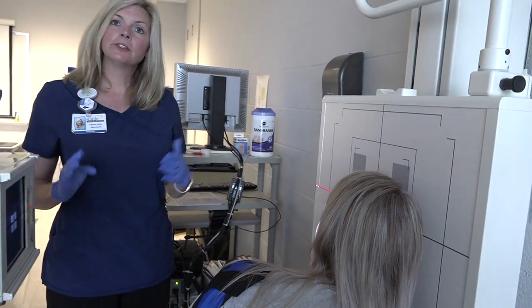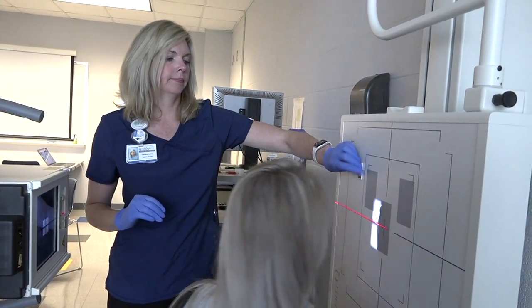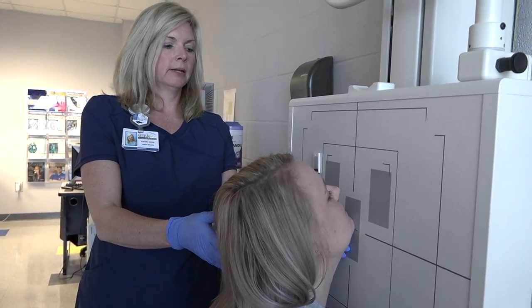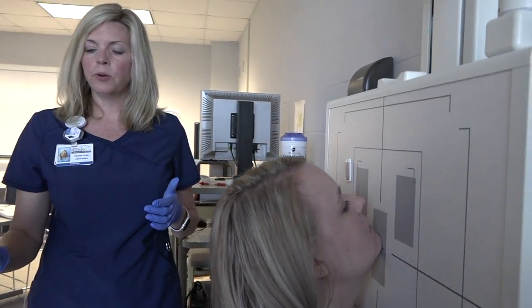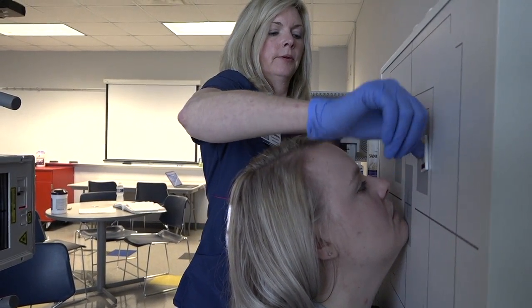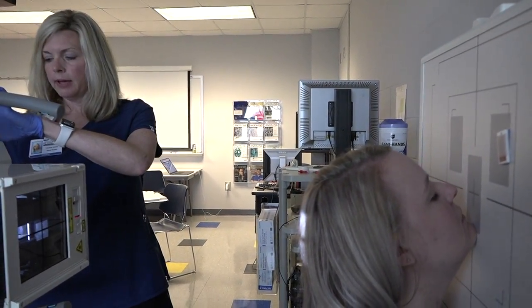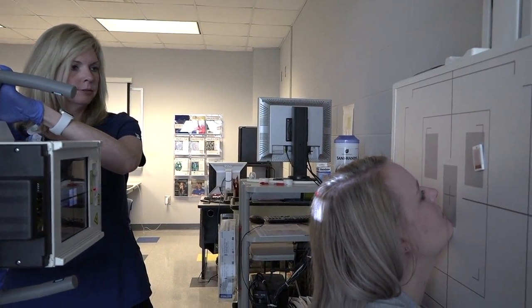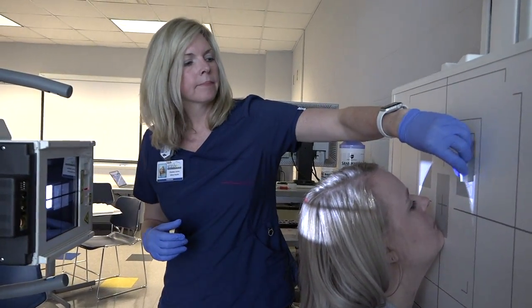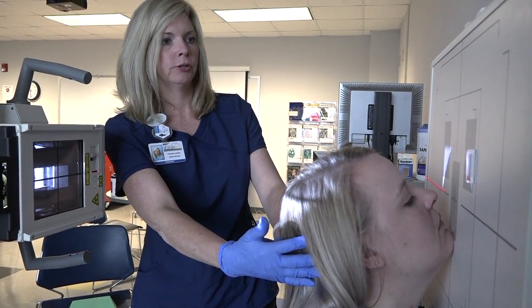Now that we have the right and left laterals, we're going to go to the Waters, which is going to be the same. We'll have the patient lift their chin so the OML forms a 37-degree angle with the image receptor. We'll move our bucky up to the bottom of the nose, line our tube up to match, and collimate as much as possible. Make sure there's no rotation or tilt.